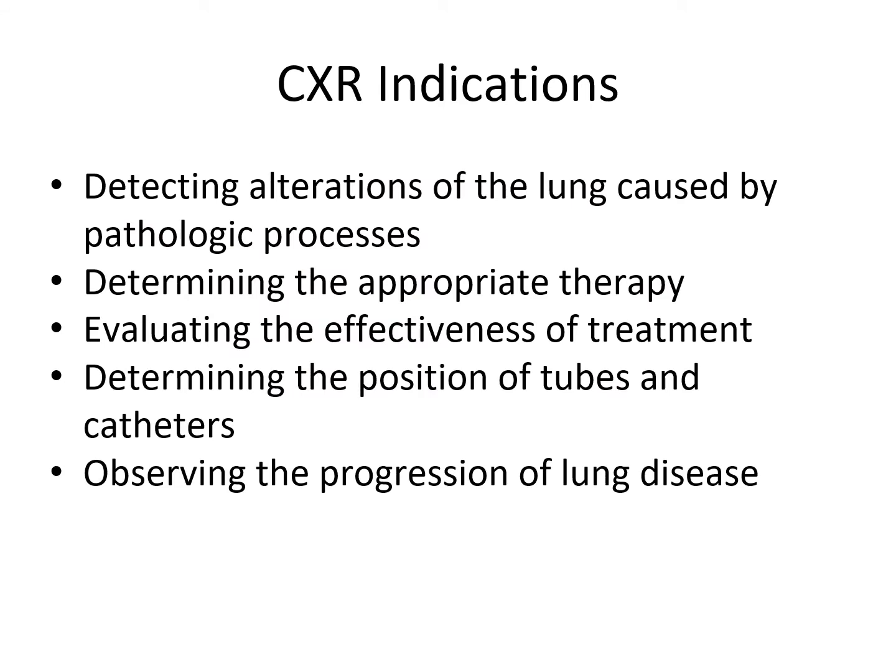So we look at X-rays to help us detect what's going on with our patient. It's a diagnostic tool to figure out if there's something going wrong, like an illness, like a pneumonia or a tumor or some type of obstruction, or we also use it to determine if our therapy is appropriate, if the medications we've been giving, antibiotics, help clear up a pneumonia.